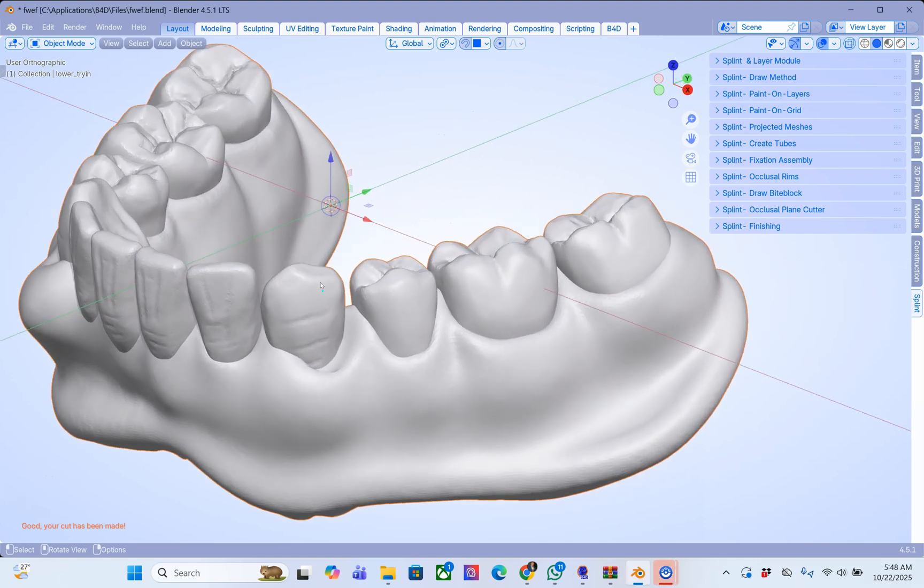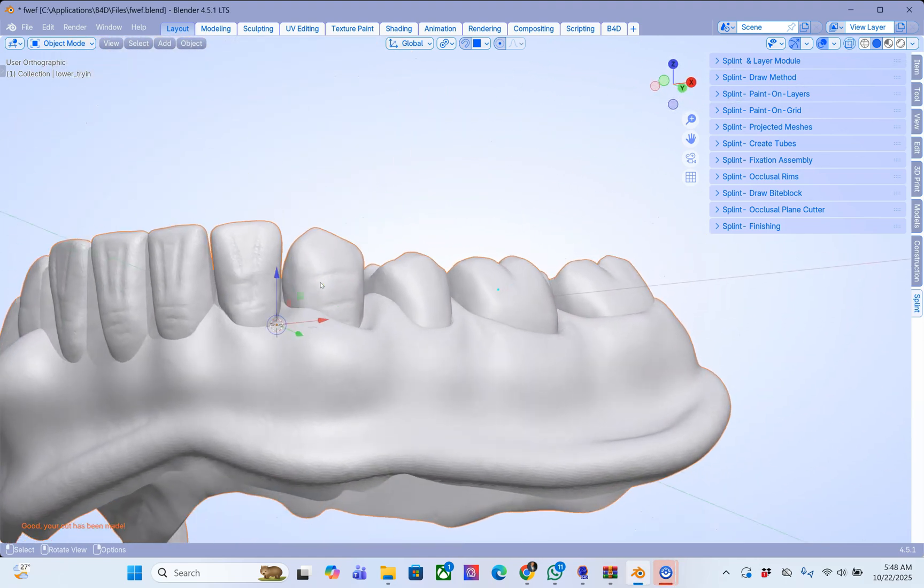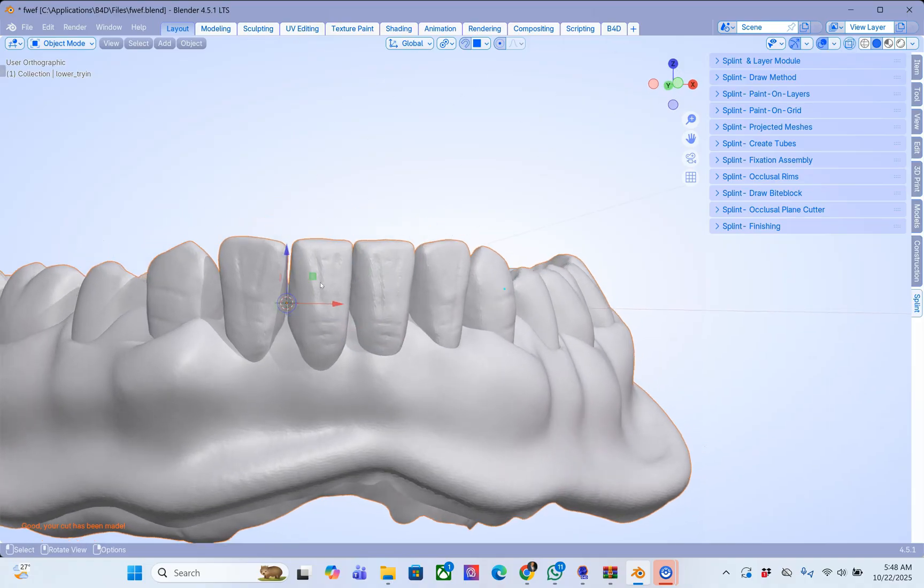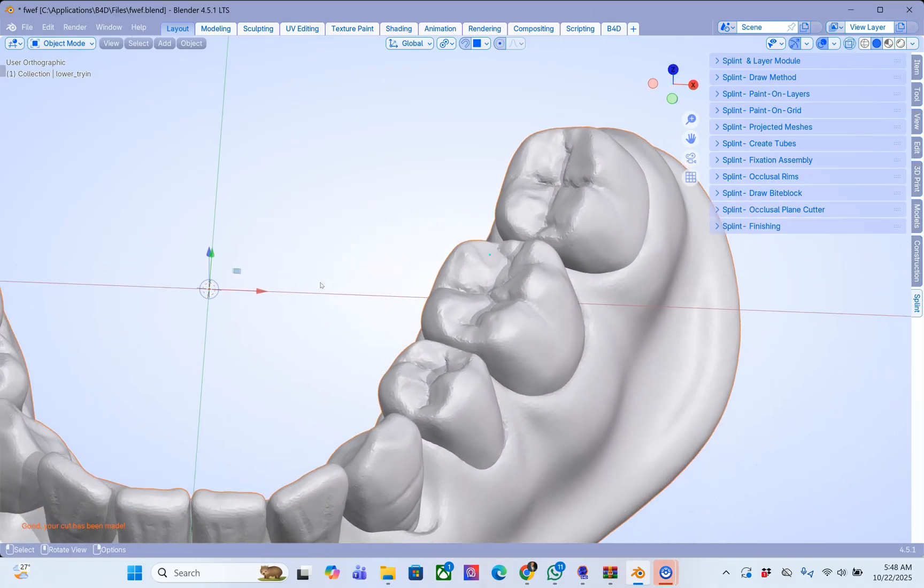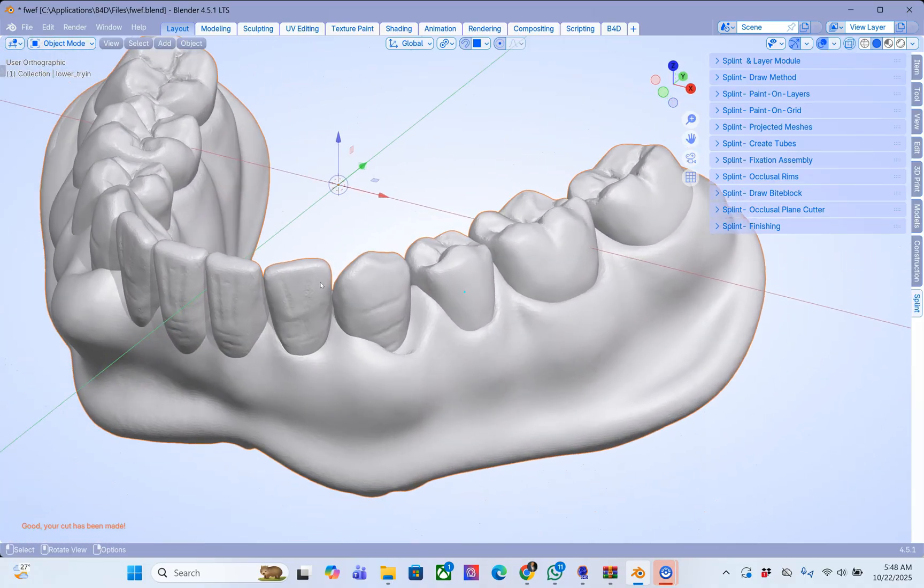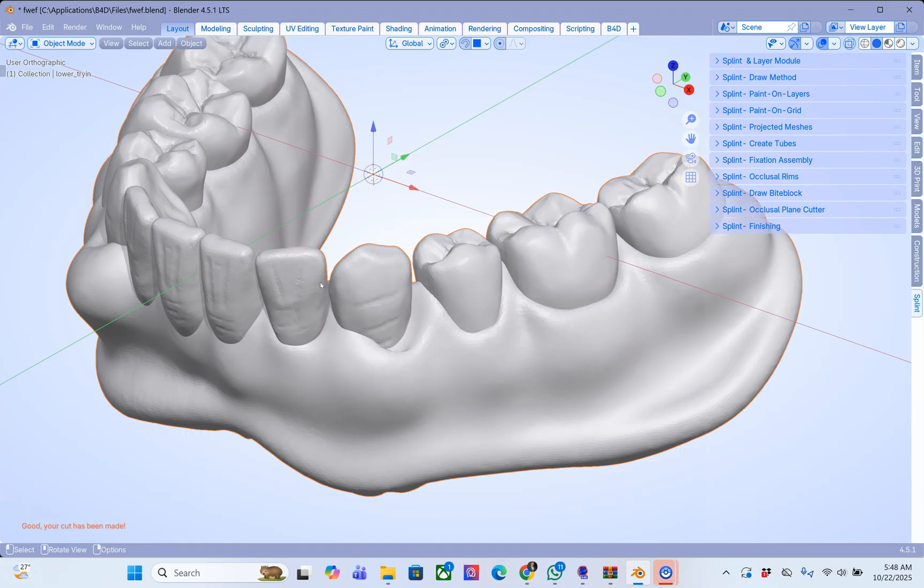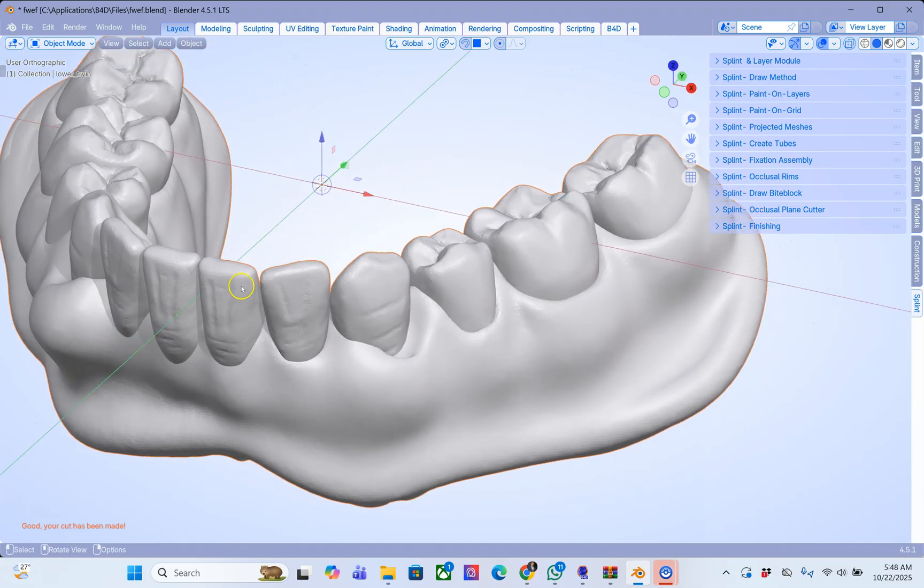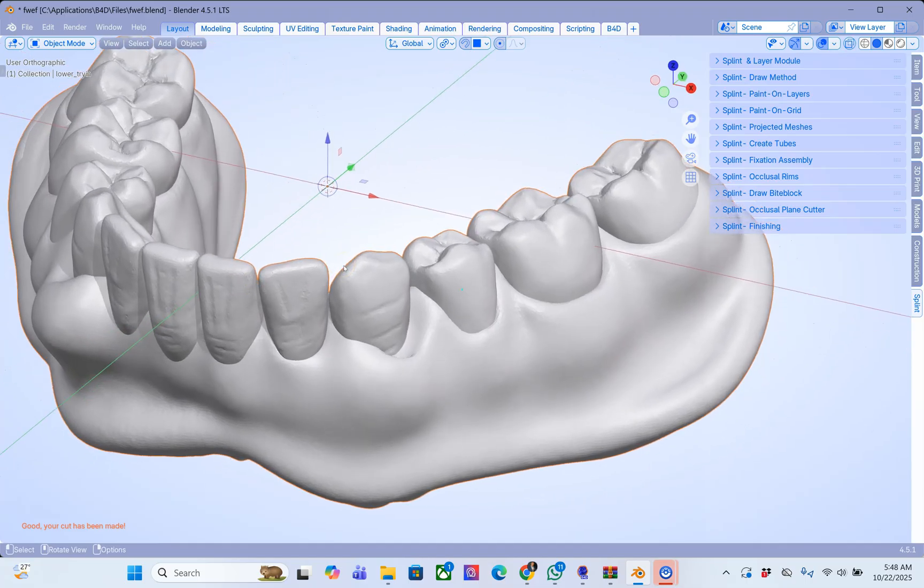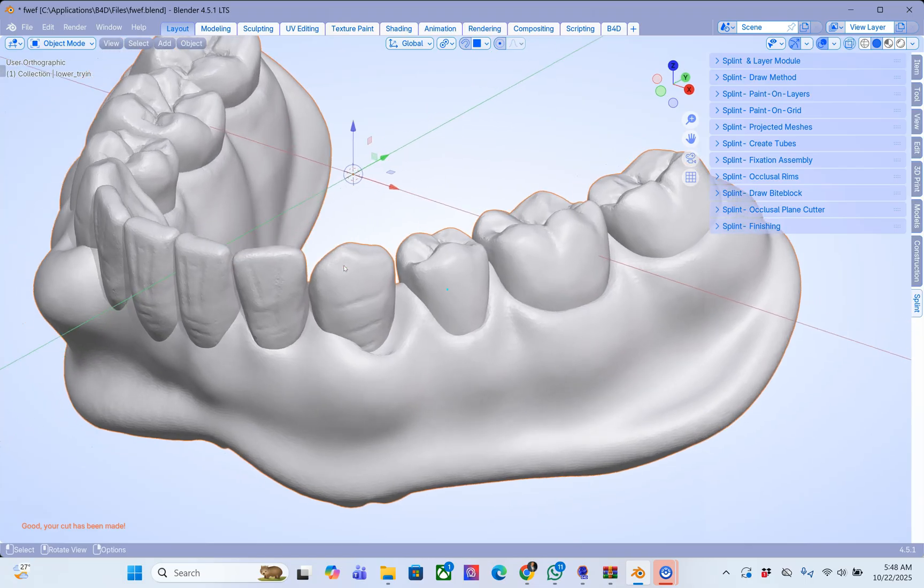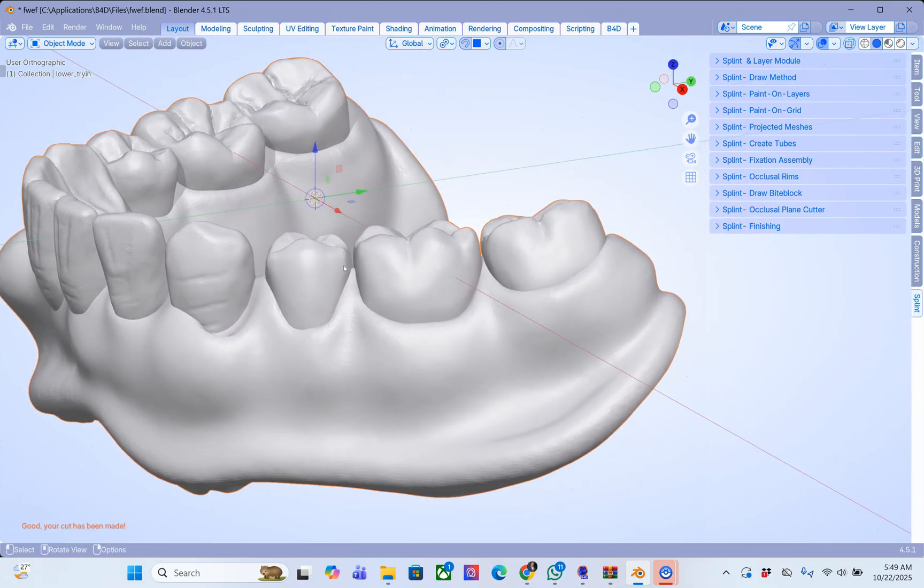In this video I'm going to be showing you how to cut the teeth off a denture. This can be done for various reasons. Maybe you want to do a copy denture or you may want to change the teeth or the angles of the teeth or whatever you need to do with it. But I'm going to just demonstrate what to do.